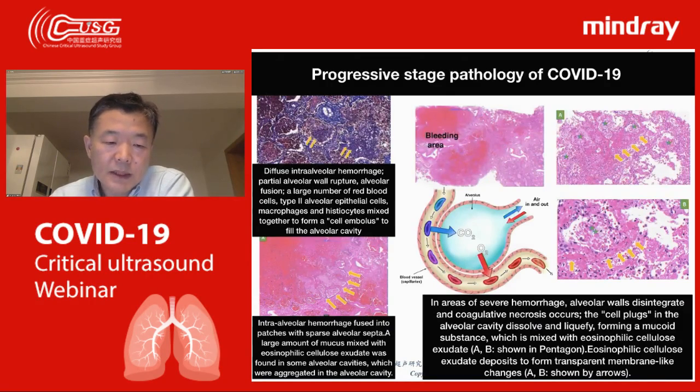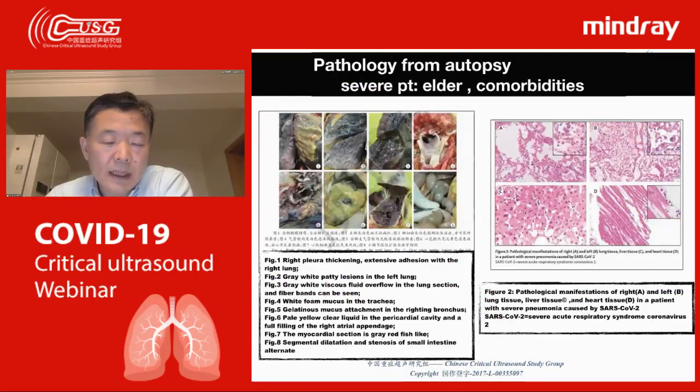So I think during this part the patient's condition is now worse than before. And this is published in the Lancet Respiratory Medicine.